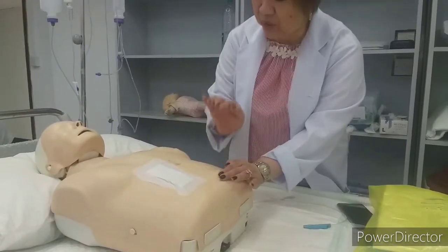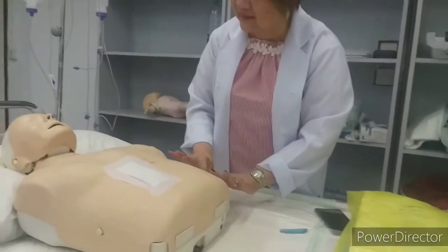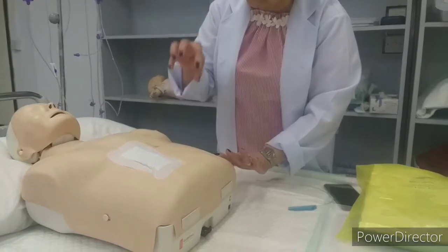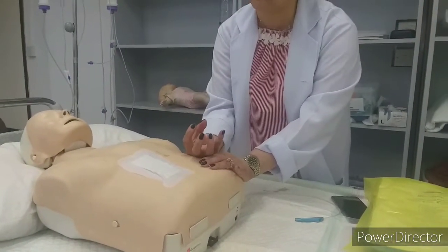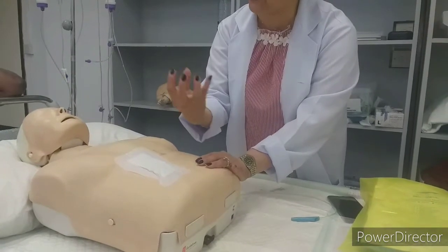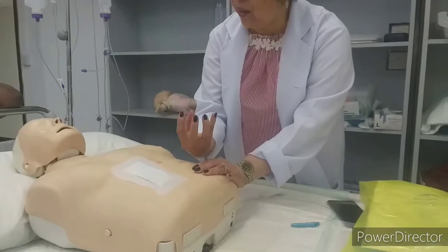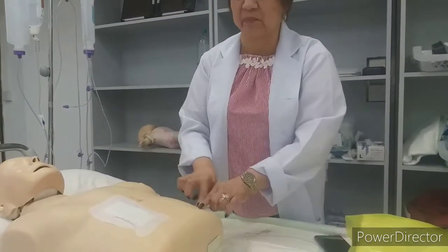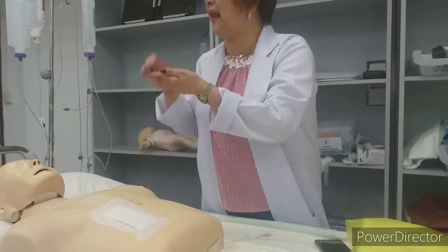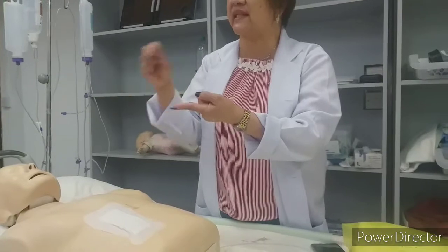Even if you put, I will just show you, with that square pad, you will put it on the skin. The colostomy will come out. The stoma, we are calling stoma. Once this stoma is out, this pad is like your ziplock. You know the ziplock in your sandwich bags?